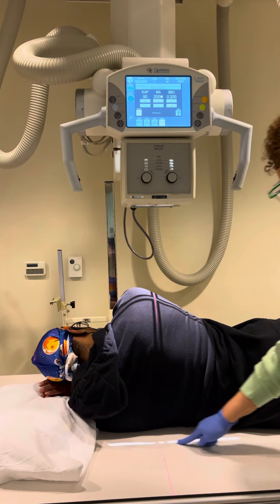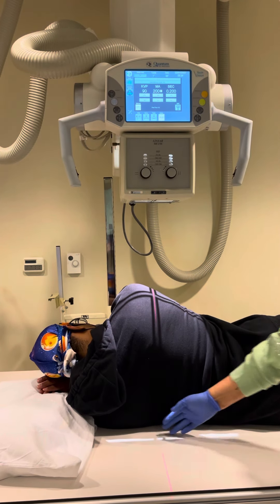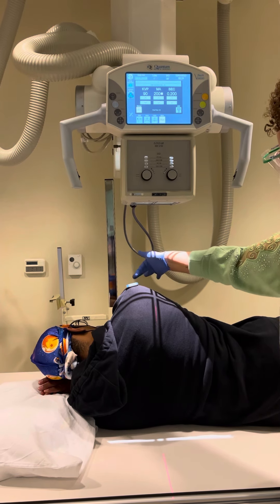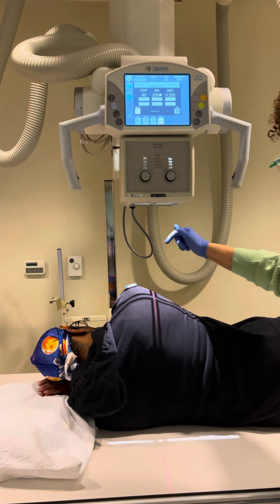As soon as I see a little bit of light on the table there, I know that I'm clear of the thoracic spine. You can place your marker up at the shoulder here, but know that it's going to be magnified, or you can put it in front of the patient.